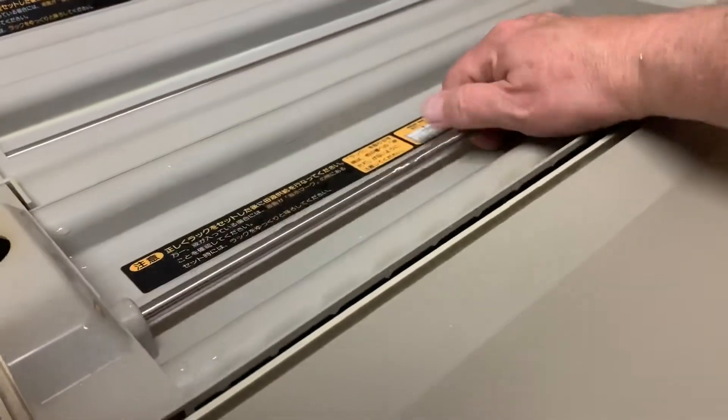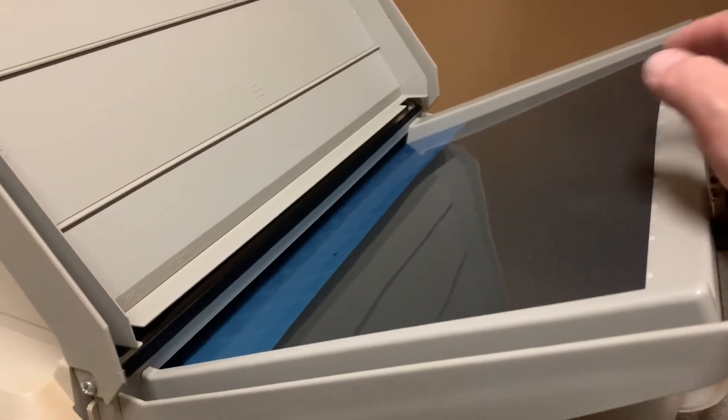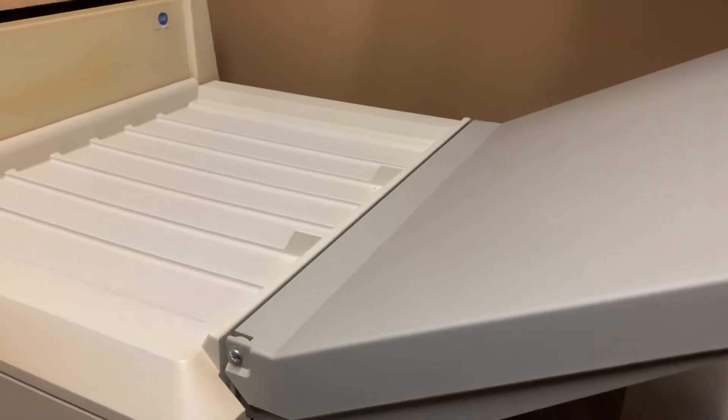Then we'll run the processor, observing to ensure that the recirculation pumps and replenishment pumps are all in working order. We'll reinstall the roller racks, then run a few cleanup and test films to make sure that the processor is in complete working order.